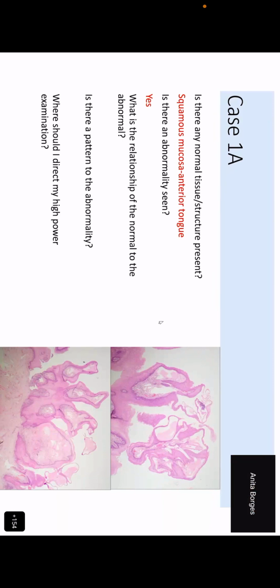Yeah, okay, tell me. And this one. That is in the epidermis? You think so? What's surrounding it? Let me ask Vimi. Do you agree that what she has drawn is in the epidermis? Ma'am, it's in the subepithelium only, I think. So why is it looking as if it is bloated? Ma'am, maybe it is pushing from the epithelial region towards the epidermis.